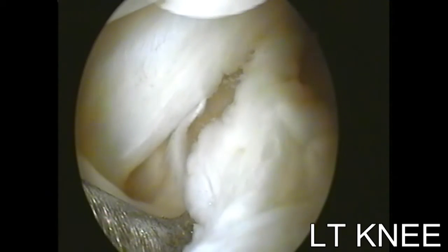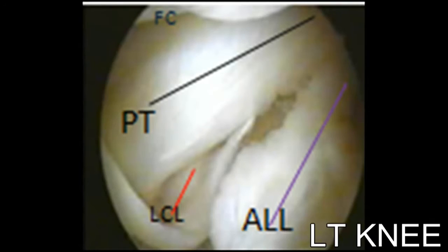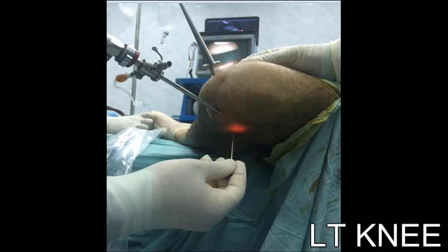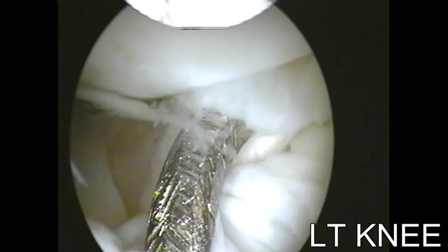The lateral three structures, popliteus tendon, ALL, and LCL, lie in different planes and their fibers run in different directions, so they can be easily identified from each other. By using a needle and transillumination, a direct portal can be developed. ALL can be assessed through this portal.